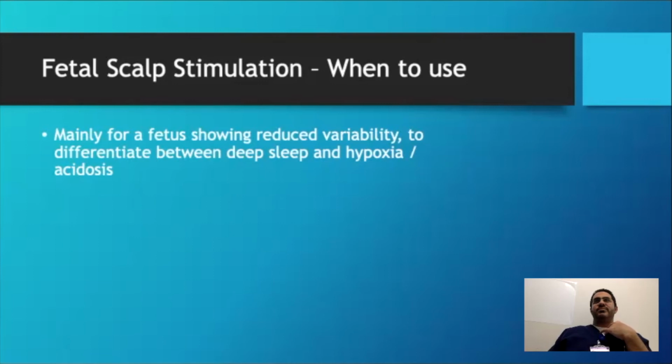Could be high, like when yesterday was high. So then you're more worried about this baby. If the baseline is high, do you think this baby is going to be fast asleep? No, this is adrenaline. If it's high because there's adrenaline release, you will never fall asleep with adrenaline rushing through your system. You will be shaking. You will be wide awake. So a reduced variability with a high baseline, that's not a sleepy baby. That's an unwell baby.